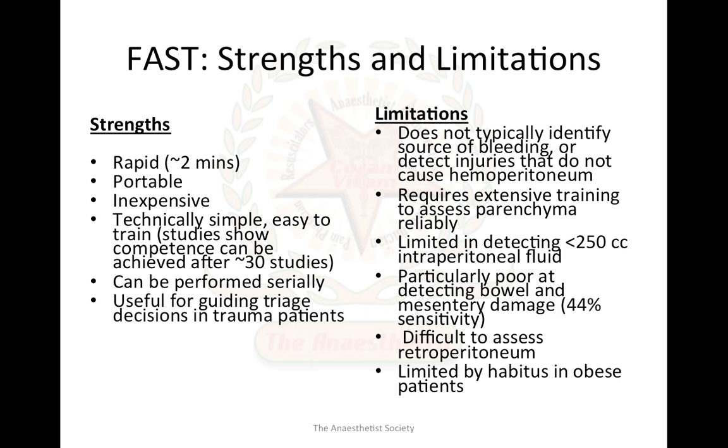Strengths are: it is rapid. After training you can even do it within 2 minutes. It is portable. You can take your ultrasound machine to the OT or ICU and do it there. It is inexpensive. There is very little expense. It is technically simple and easy to train. Studies show that competence can be achieved after 30 studies.